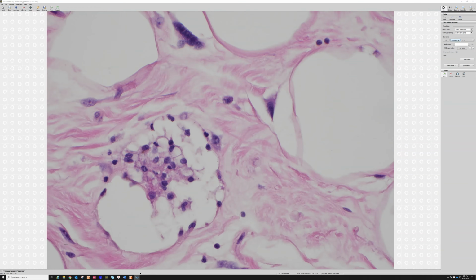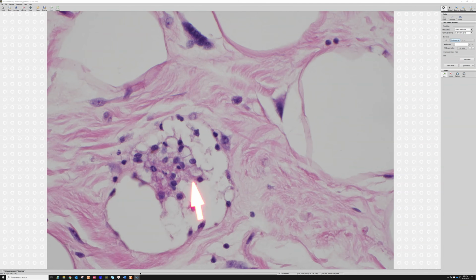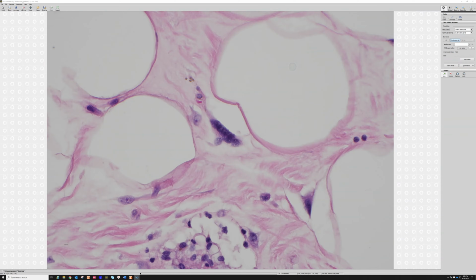And look, they have relatively paler chromatin. It doesn't always work. This one has a little bit of bean-shaped nucleus too, but I feel like under the microscope when you look, they usually look a little different. The histiocytes tend to have more fine, delicate chromatin. These ugly guys, the pleomorphic cells of well-diff liposarc, tend to be more hyperchromatic, smudgy, kind of chunky, grungy looking chromatin.